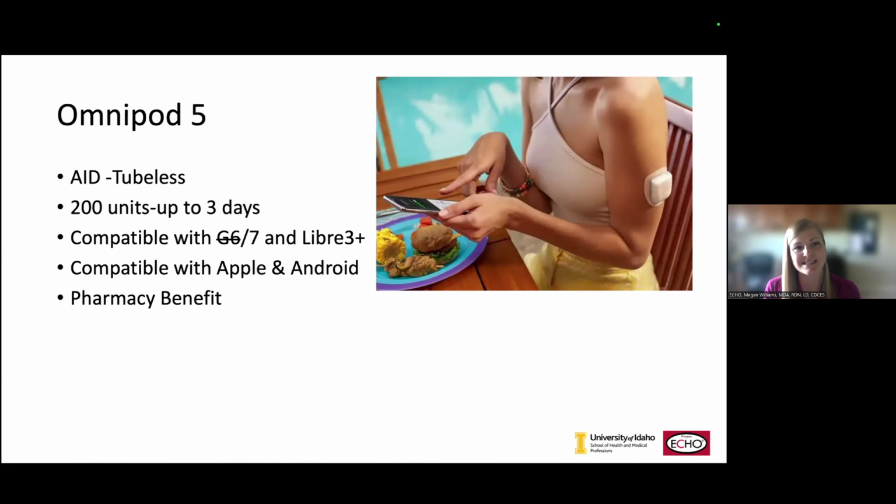We're going to see in our case study a Tandem report. Tandem does microbolusing throughout the day in addition to other pump systems. Omnipod does not. But I can tell you that it's hotly debated online. I love getting into the chats online to see people say, no, you need to do this pump. No, you need to do this pump. And this one's my favorite.